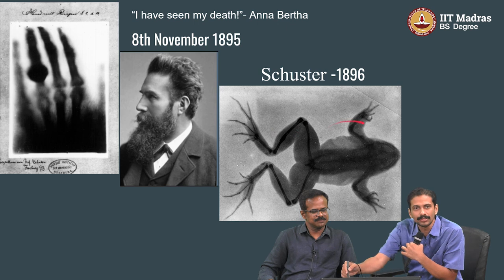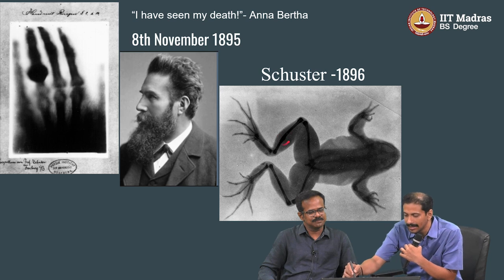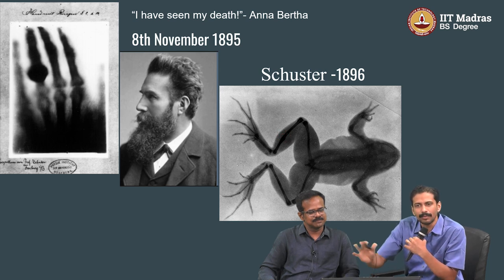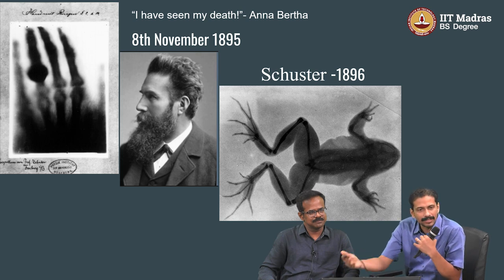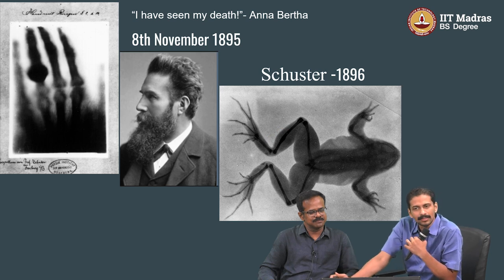Okay, so this is a frog, and this is a radiograph of the frog. In any radiograph, you can see all the bones nicely. That's how X-ray is very important to us. Fractures are much better seen on X-rays. And here you can see that in the location of the right leg or somewhere, there is a bulge. This is a callus formation, which is a reparative thing, the way a fracture heals with callus formation. So with the callus formation we know that this is a fracture which happened a little while back, maybe 10 or 15 days back to this frog.